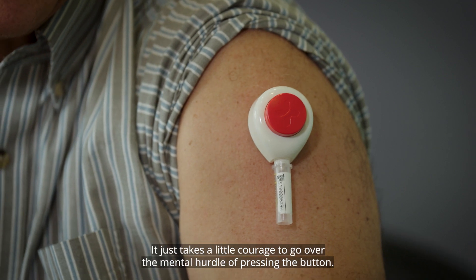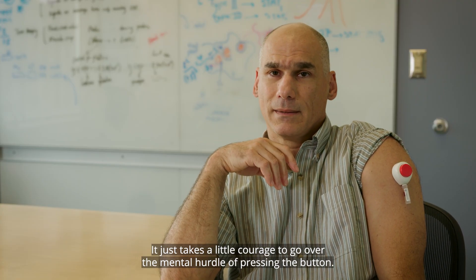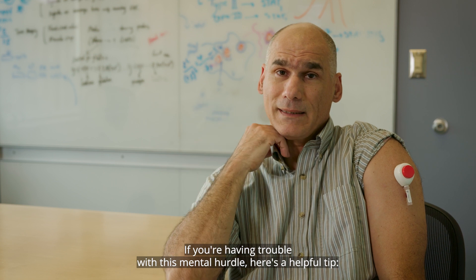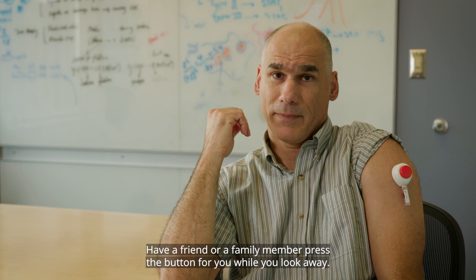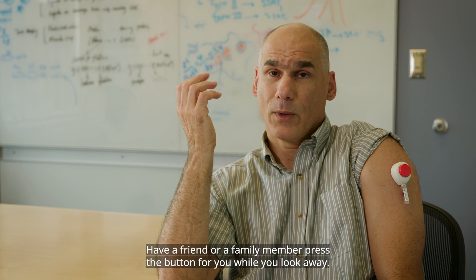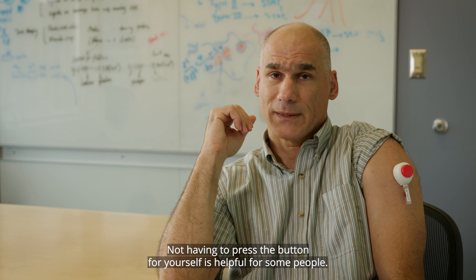Honestly, it did not hurt at all. It just takes a little courage to go over the mental hurdle of pressing the button. If you're having trouble with this mental hurdle, here's a helpful tip: have a friend or a family member press the button for you while you look away. Not having to press the button yourself is helpful for some people.